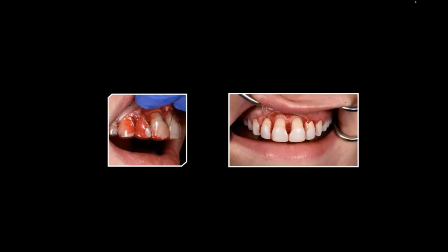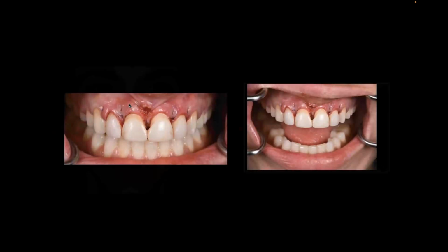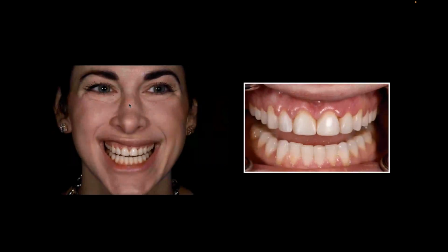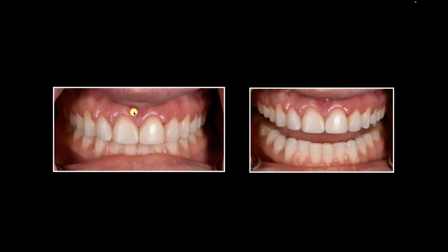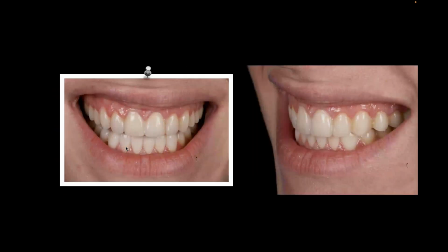Okay, so we'll finish up the crown lengthening. We'll let our patient heal a little bit. And even walking around healing, you can see it doesn't look too bad. It's just a little bit of puffiness as the patient's healing up. Then a few weeks go by, and the papilla starts to fill back down. We now have the new free gingival margin where we like it to be. And we're going to provisionalize it. We're going to prep and provisionalize the patient based on our original wax up.